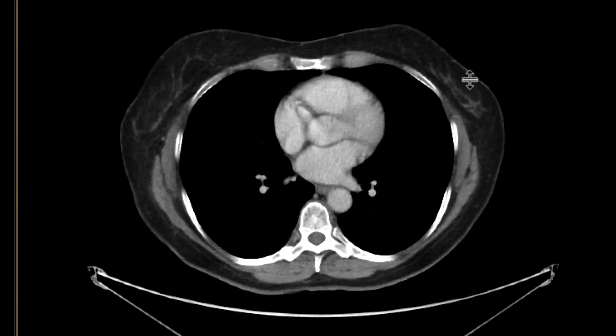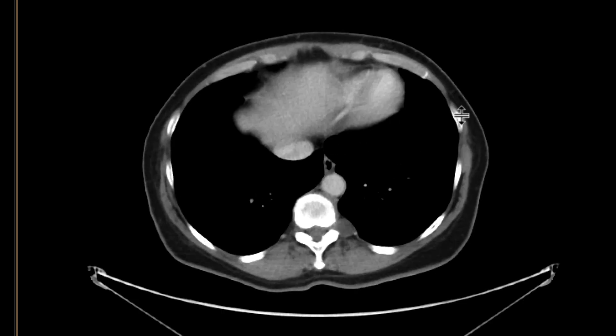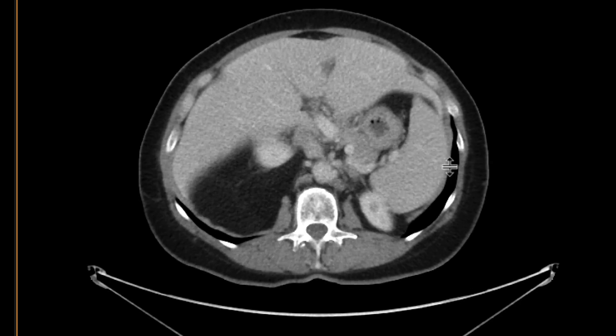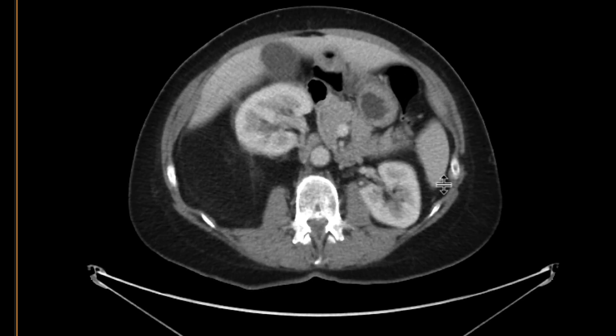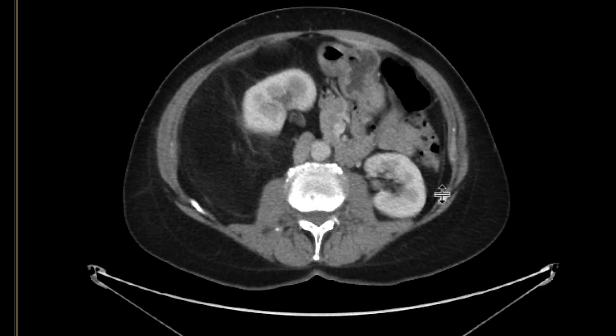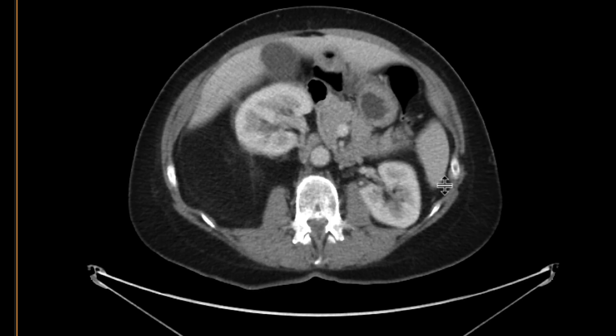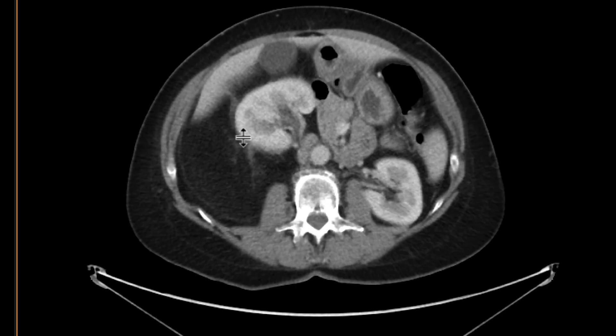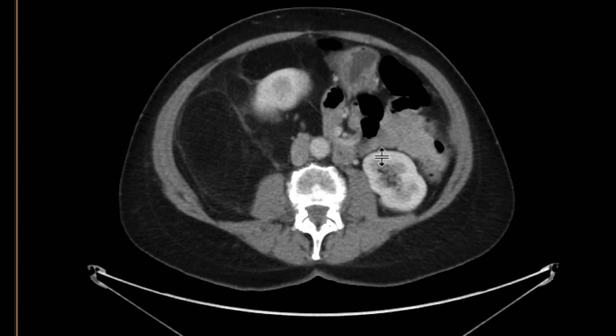We do a CAT scan to further evaluate this, and indeed that's what we find. We can see the right kidney over there, and we can see it's displaced anteriorly through all this fat that's sort of centered in the right perinephric space.